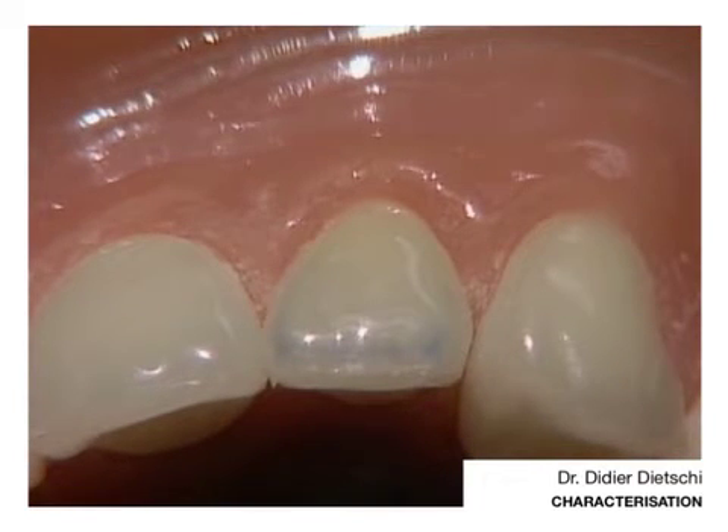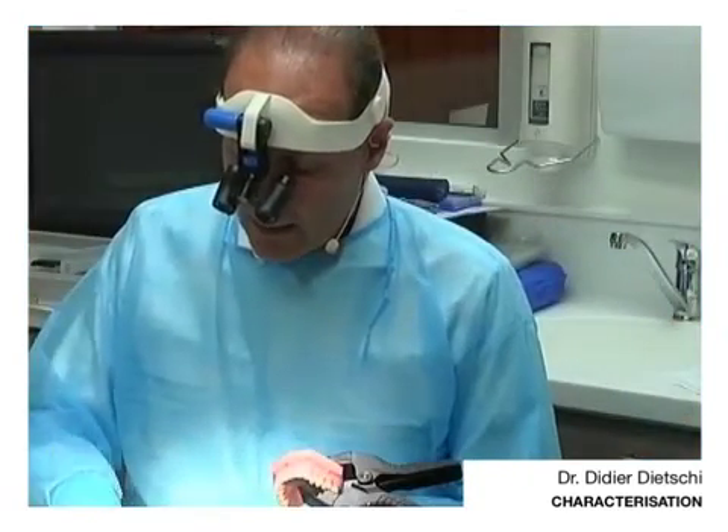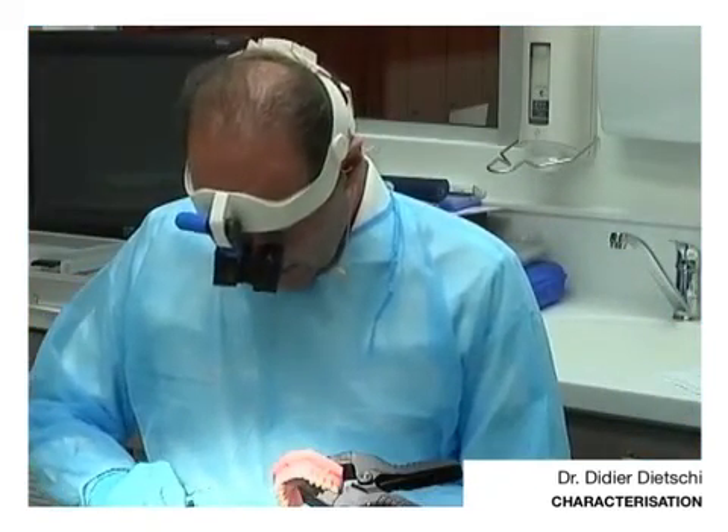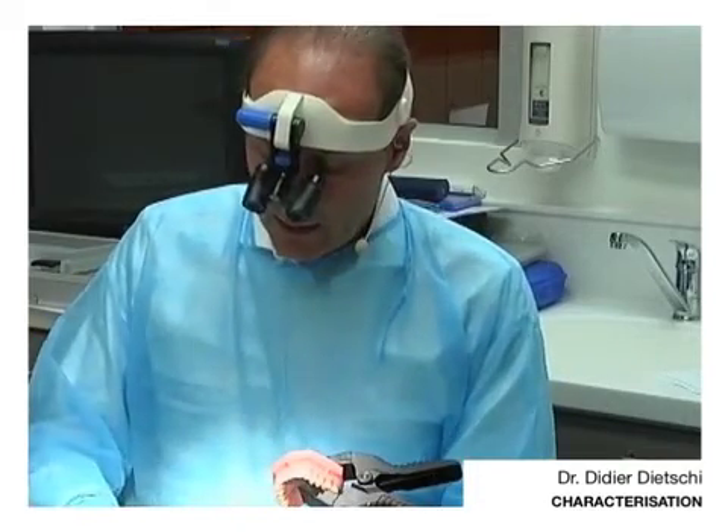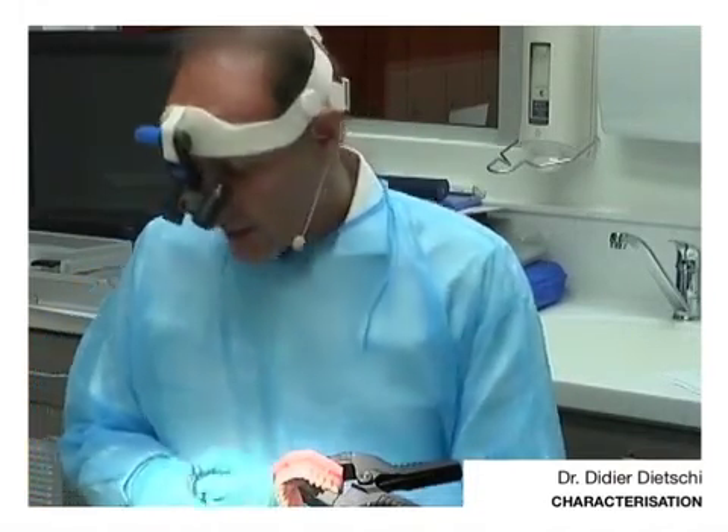Would you go for a full set of veneers? I would say this is probably very nice if you can produce this kind of characterization. And I will go quickly with the finishing of my restoration.